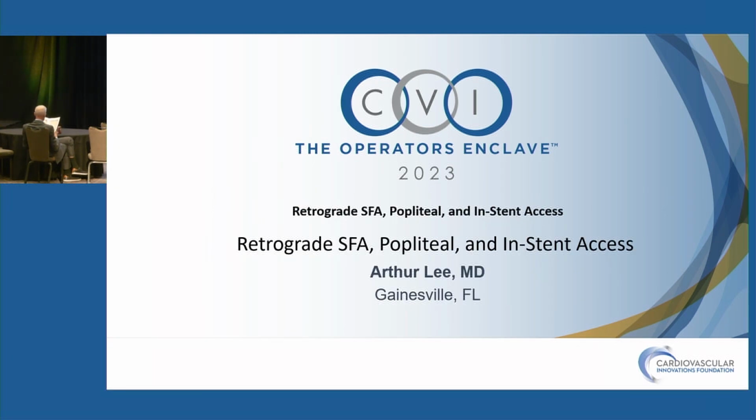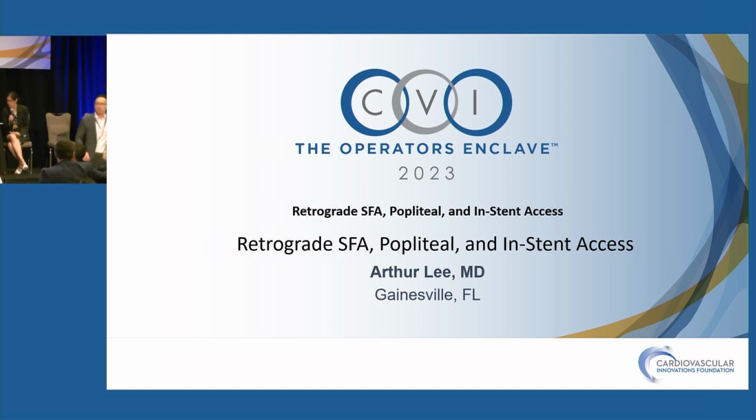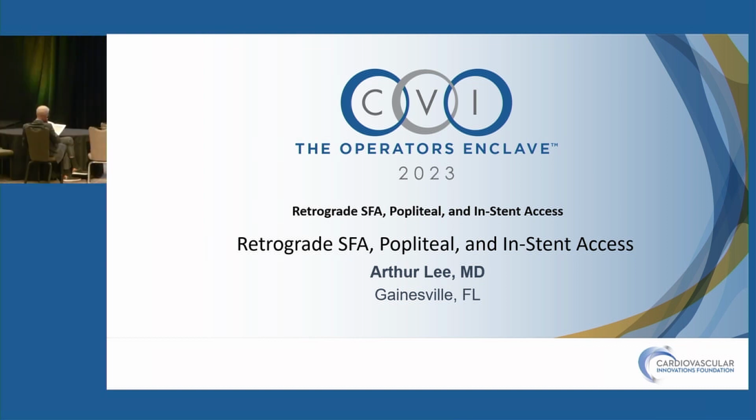I'm going to introduce now our next speaker, Dr. Arthur Lee, who is going to continue on this topic of retrograde access to talk about retrograde SFA, popliteal, and in-stent access. Thank you.